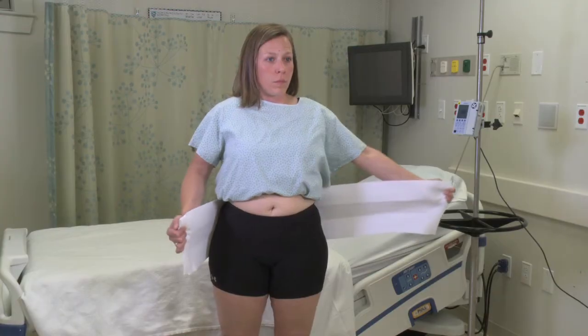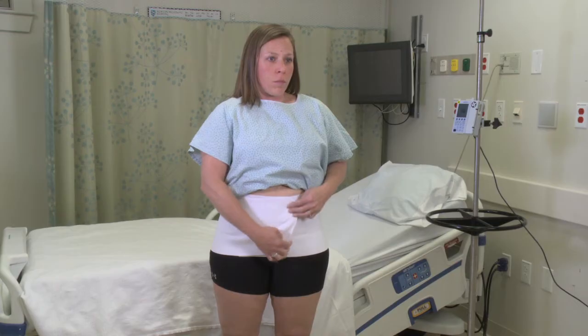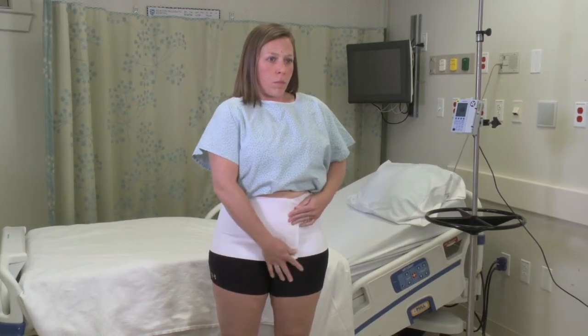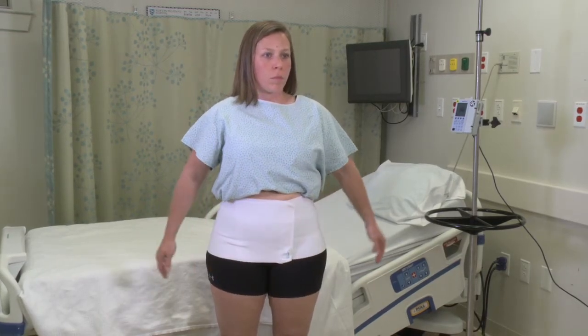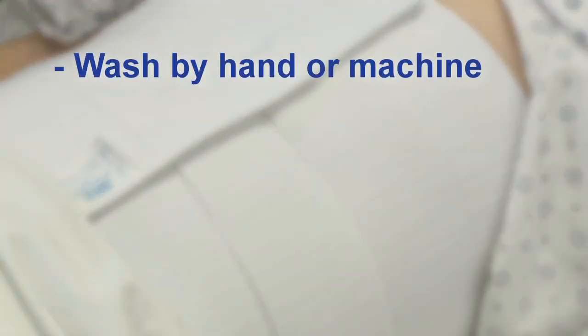Patients may take their Dale binders home for continued benefits both during and after recovery. It fits inconspicuously under clothing to provide comfortable support as normal activity resumes.